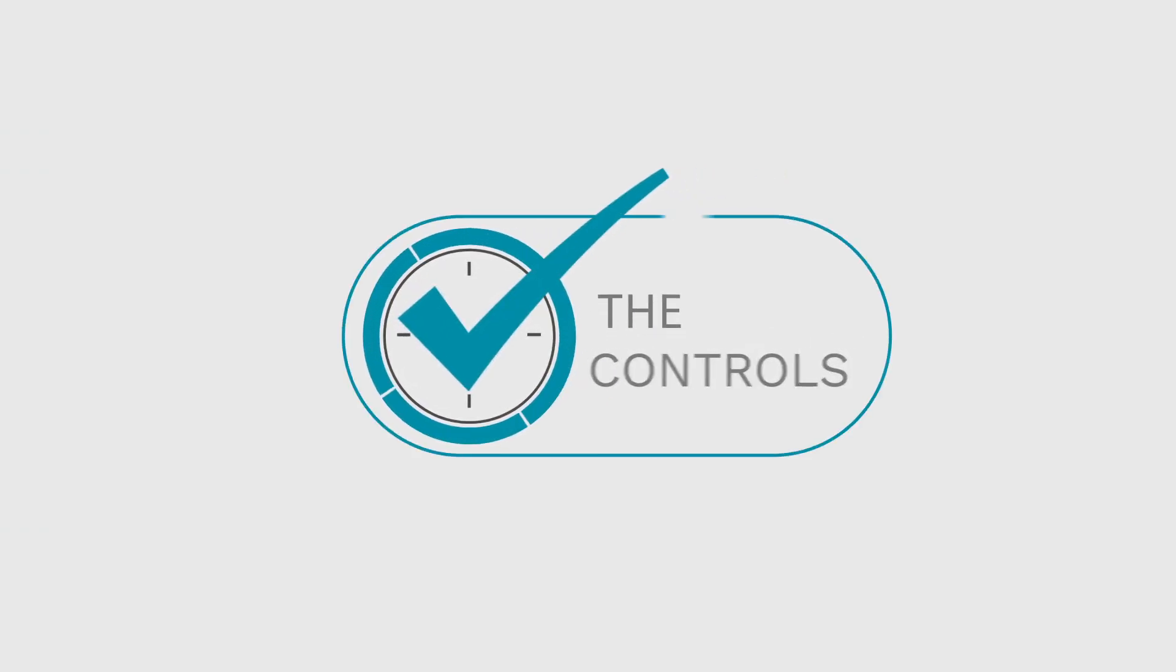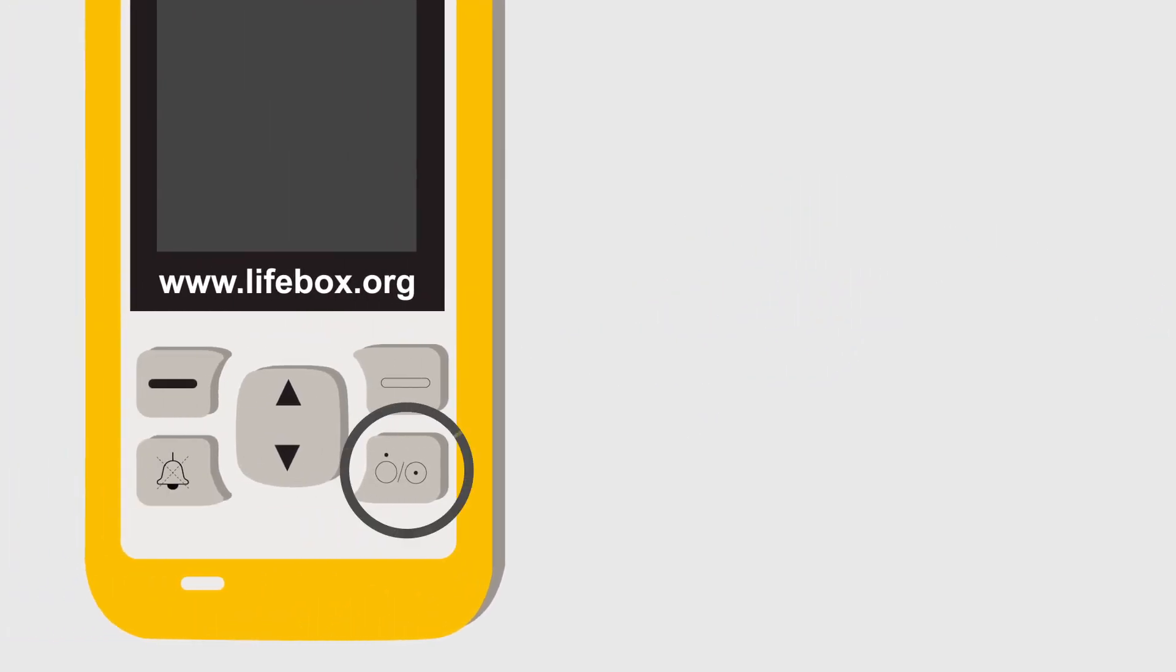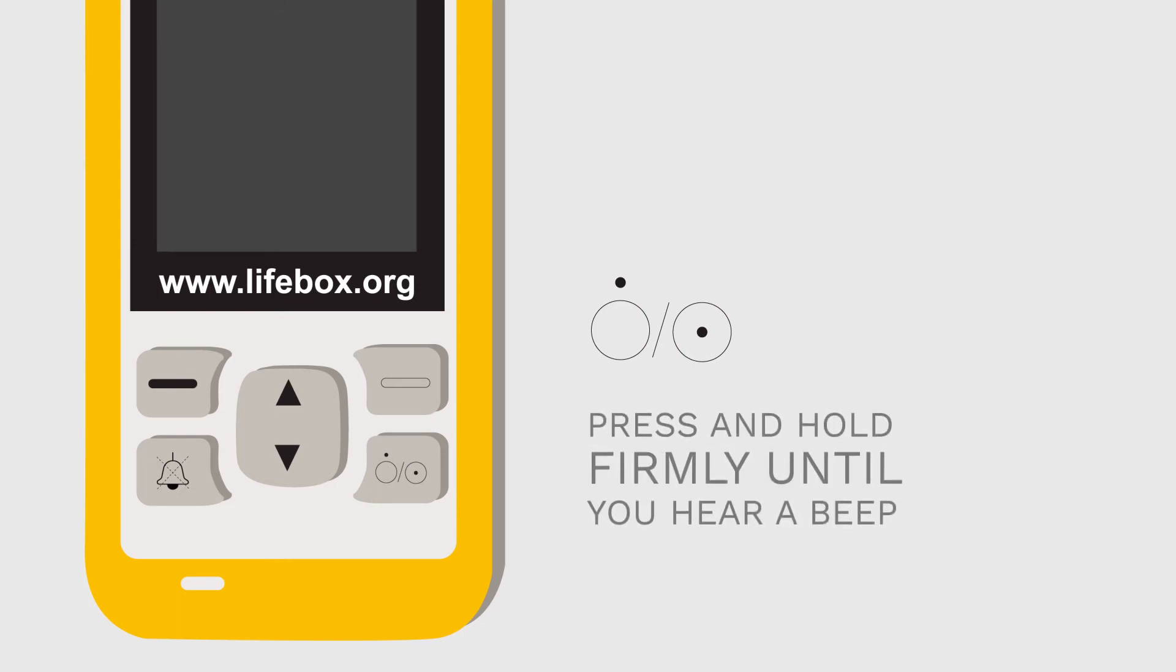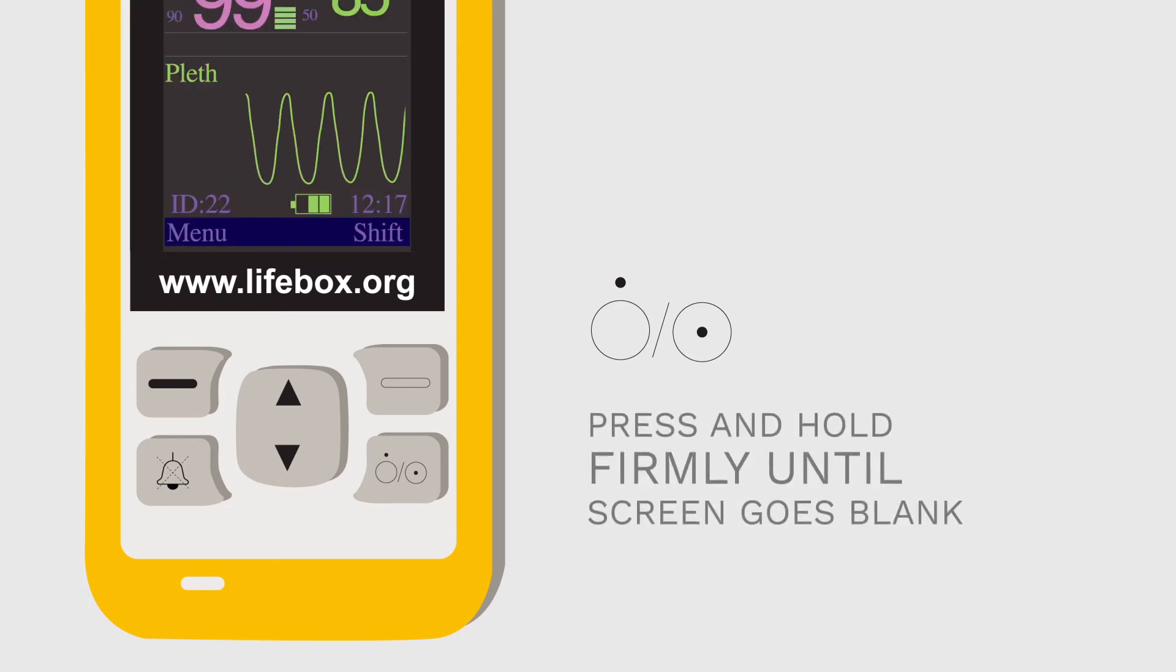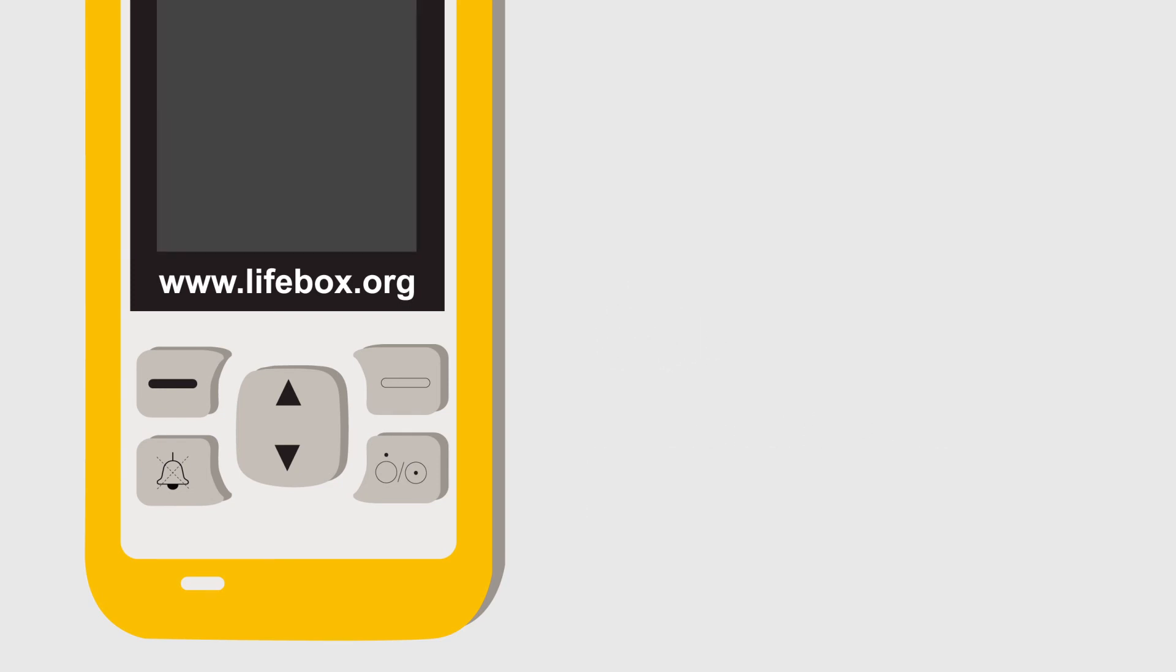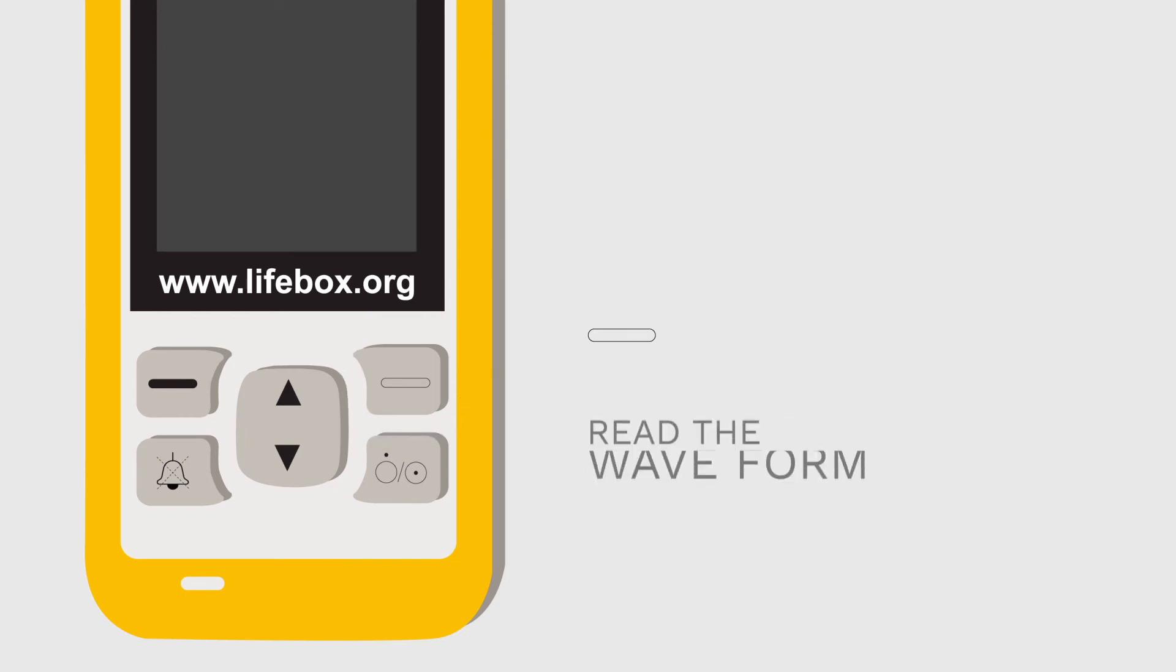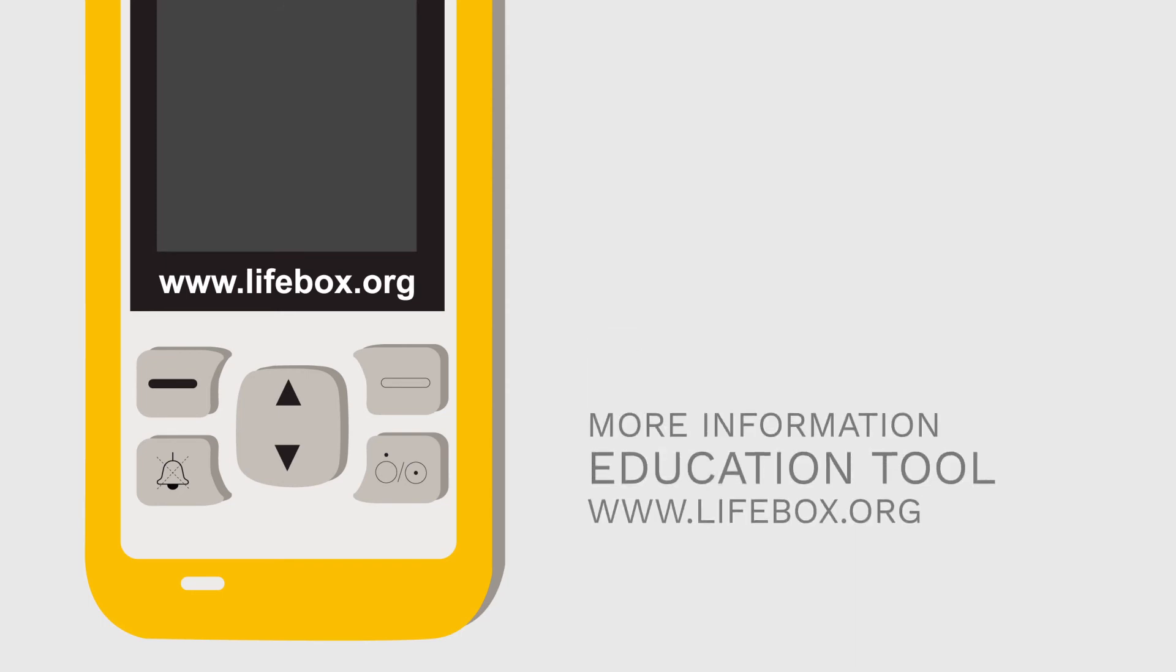The first button to recognise is this one here, which is your on and off switch. Turn on, press and hold firmly until you hear a beep. To turn off, press and hold firmly until the screen goes blank. Right above it is a button that allows you to turn the pulse rate waveform on or off. You can read the waveform to obtain additional information about your patient's circulation. To learn more, refer to the education tool or the Lifebox website, www.lifebox.org.